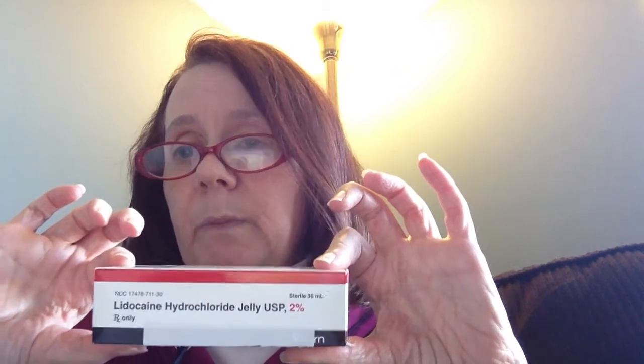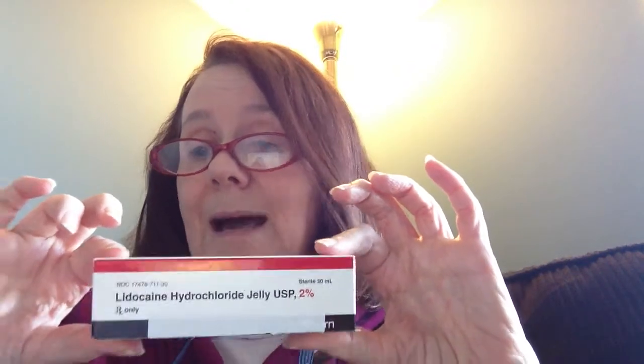So then what I do is lidocaine gel. This is my lifesaver. Not only do I use it for catheterizing, but I use it for my vulvodynia, my urethra pain. I use it for a multitude of issues. I love lidocaine gel. Some people can't tolerate it, I know. Some people love it like me. I couldn't live without it. And my doctor has written the prescription so that I get 2 of these boxes at the same time. And it's wonderful. I use 2%. You can get 5%. 2% works fine for me.